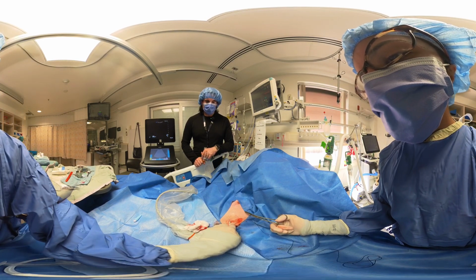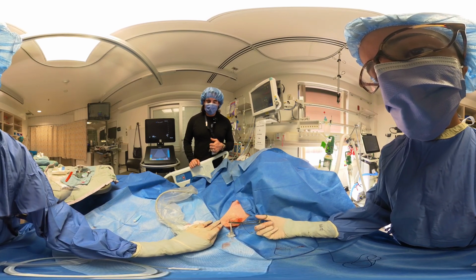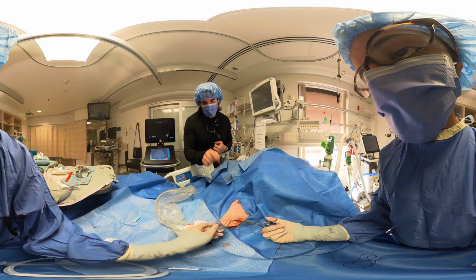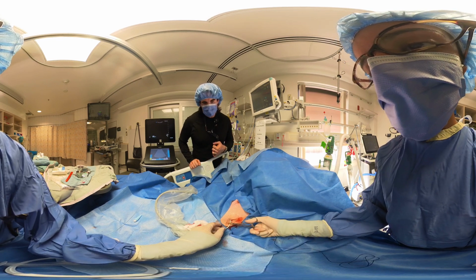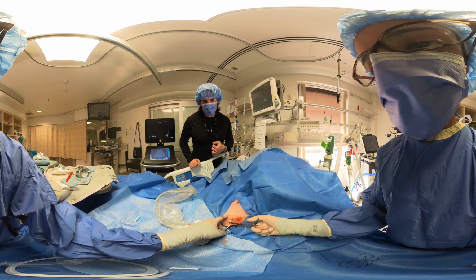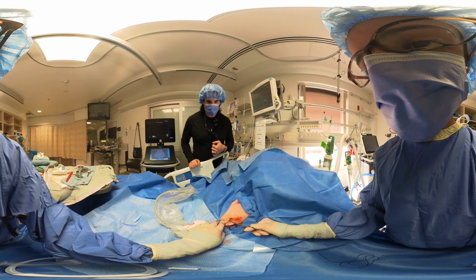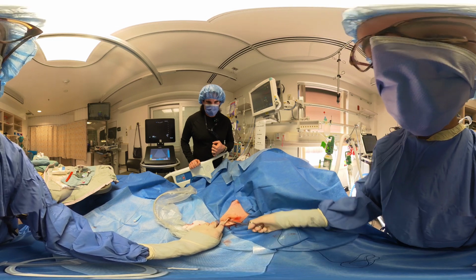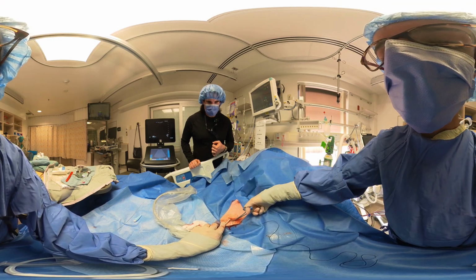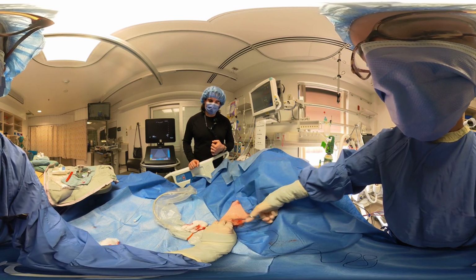So I would just first make an incision here? Or just on one side of the tube, just pass it through the skin. So we're going to pass through the skin just maybe a quarter of an inch away from the tube. Yeah, just right there, pass it right through. Okay, being sure not to poke yourself here, of course. This is a bit of a bigger needle, so it might take a little bit extra.